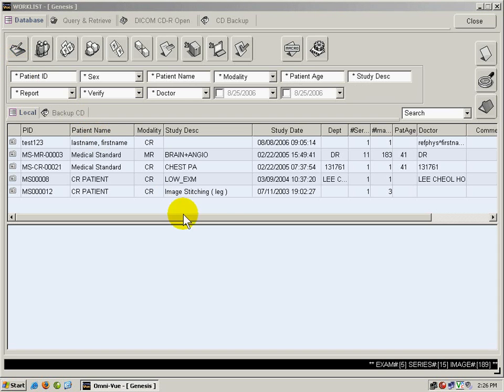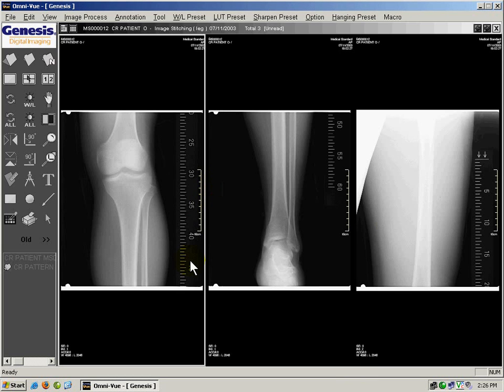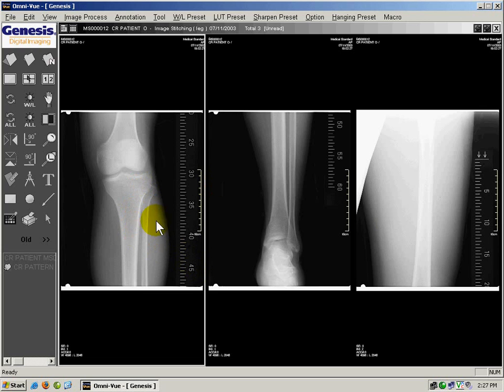I'll go back to the work list and open the study for which I would like to send the email from. With the study open, we can select multiple images by holding the CTRL key on the keyboard. I'm holding CTRL and I'm going to left click on the images that I would like to email.